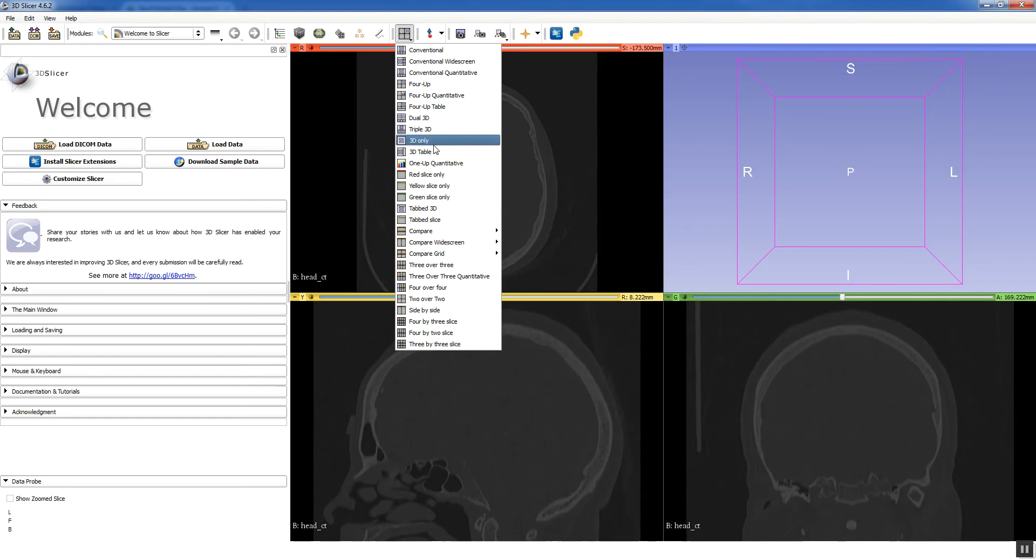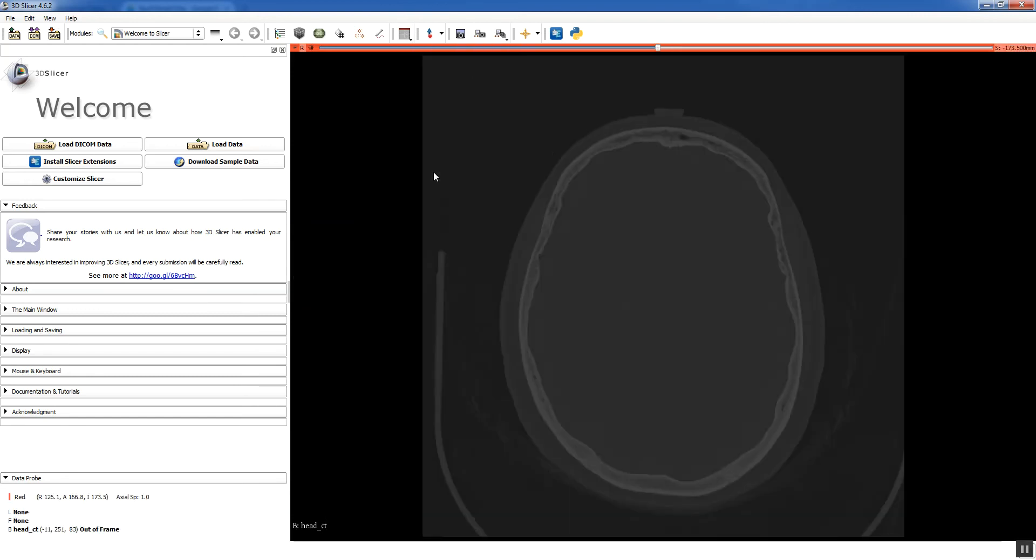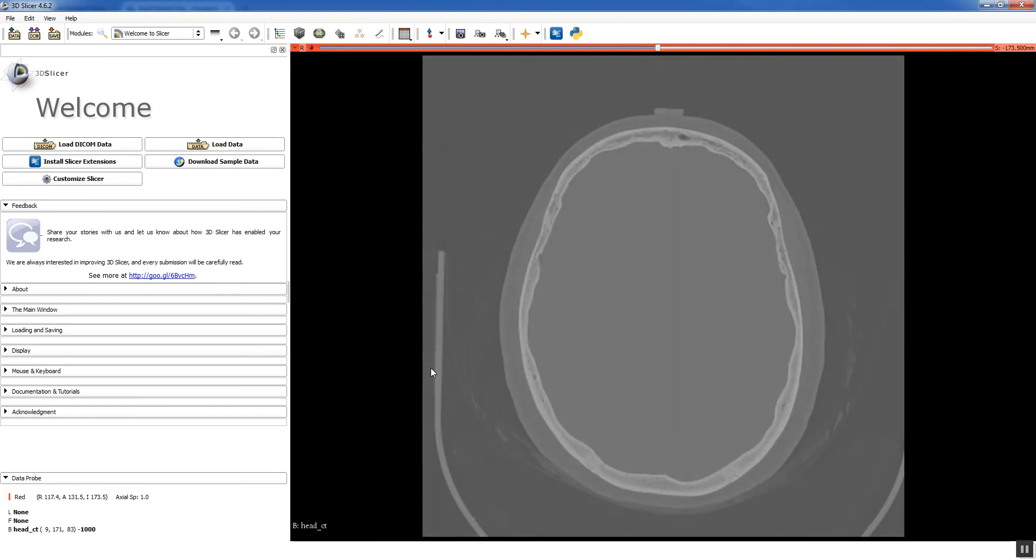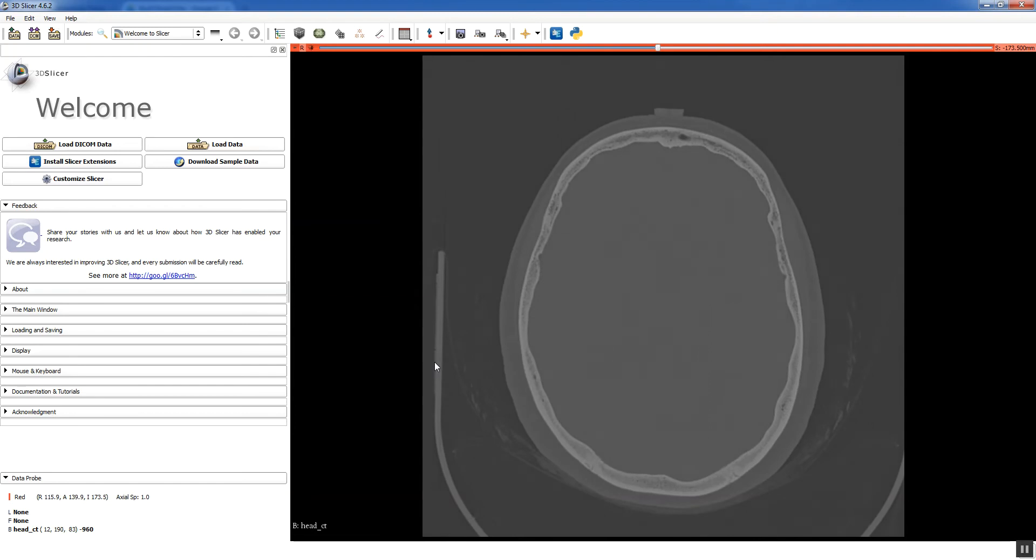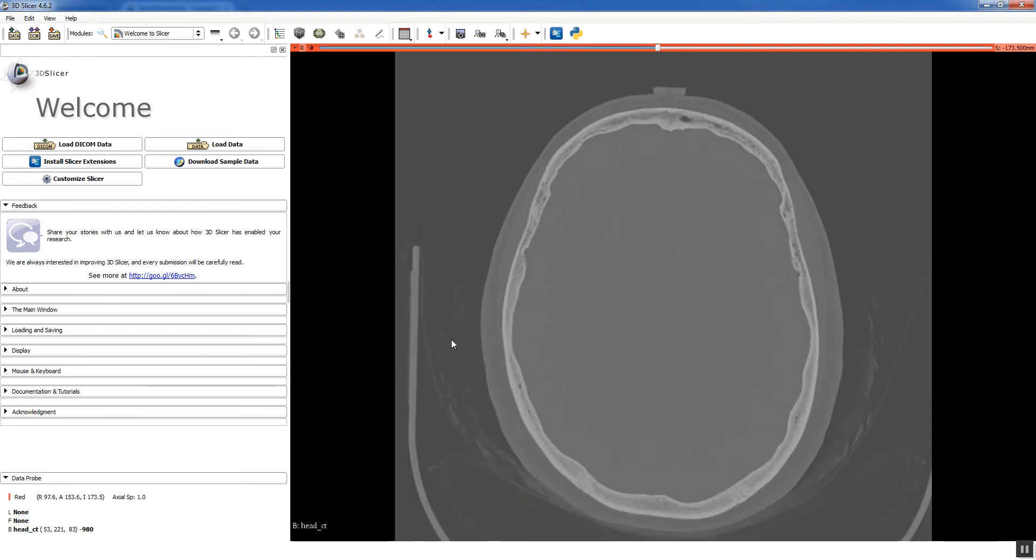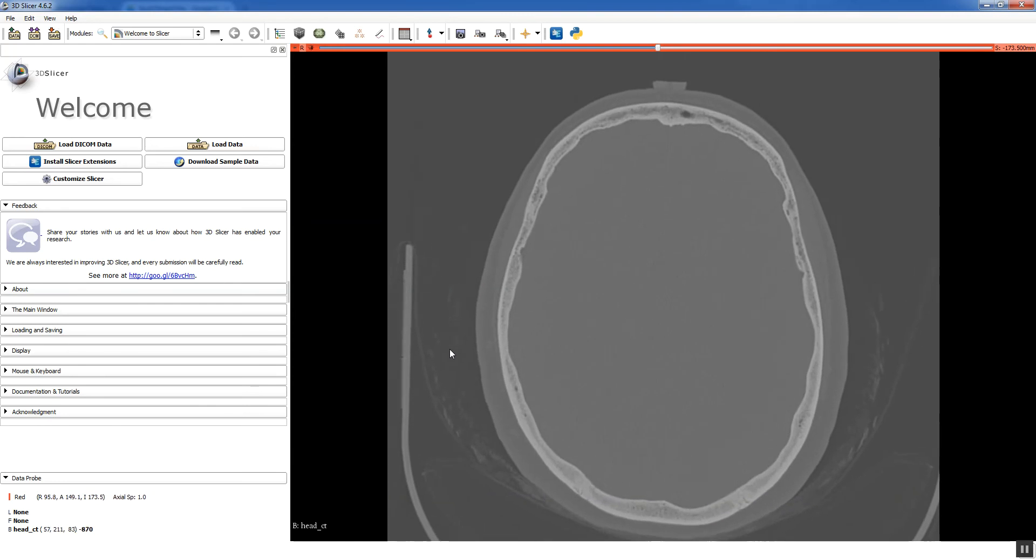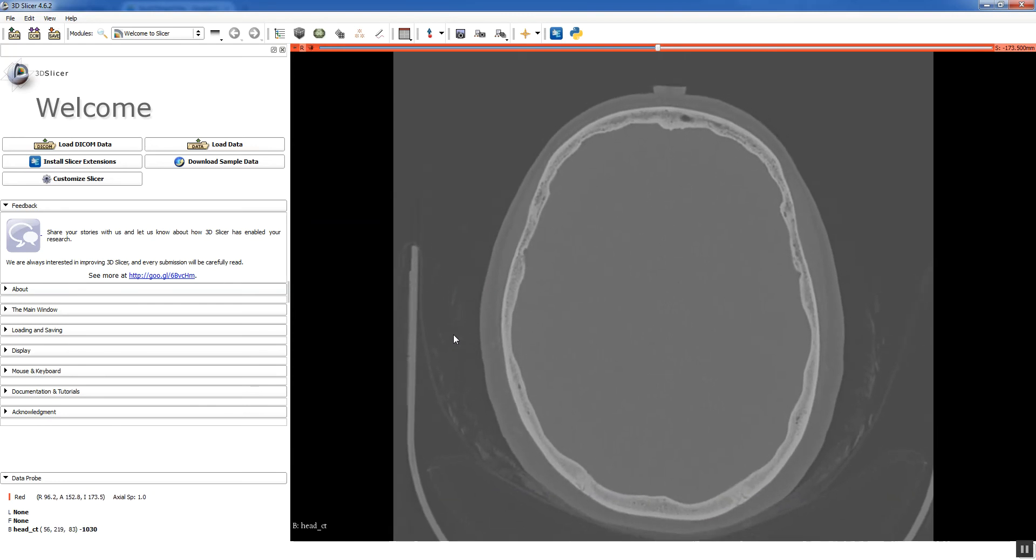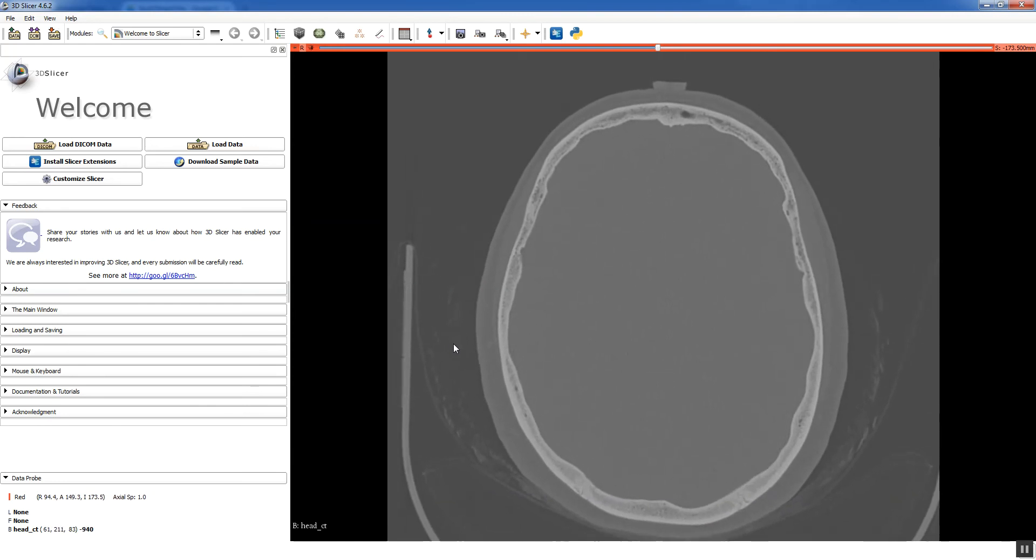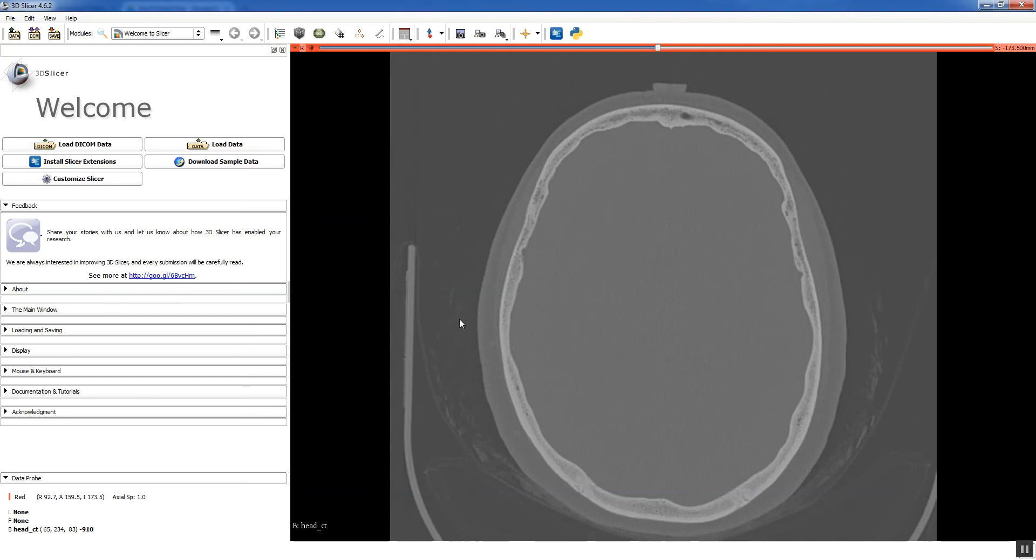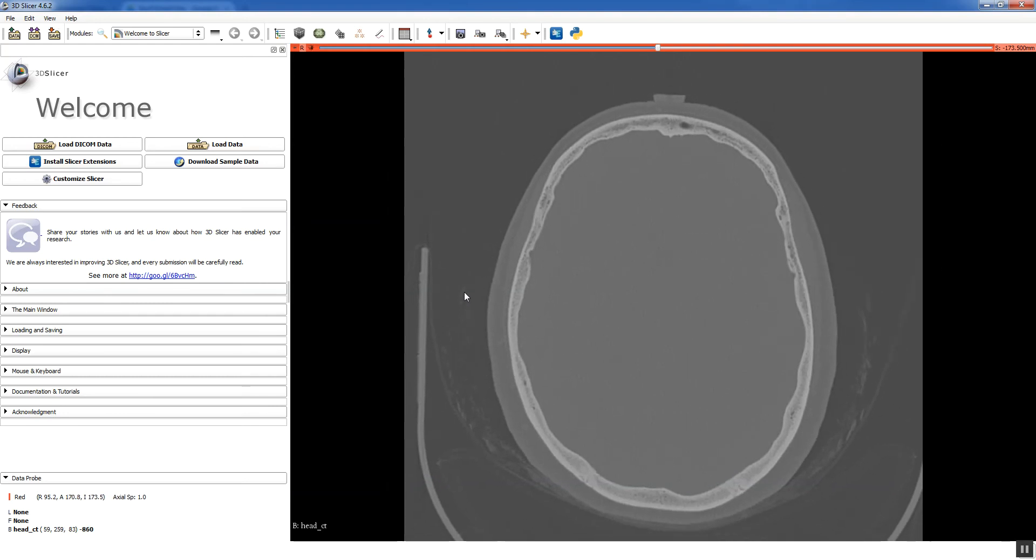So let's just look at the axial slice for now. A couple other controls. If you left click and drag, that lets you window and level your image. So you can make it look a little bit better. And then right clicking and dragging allows you to zoom. That's pretty helpful for segmentation sometimes if you're trying to get tiny details.